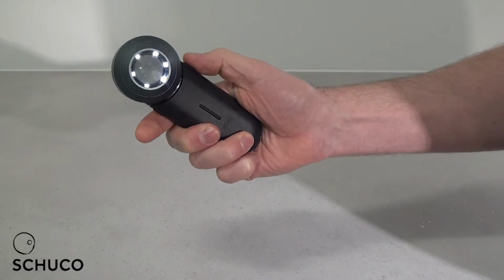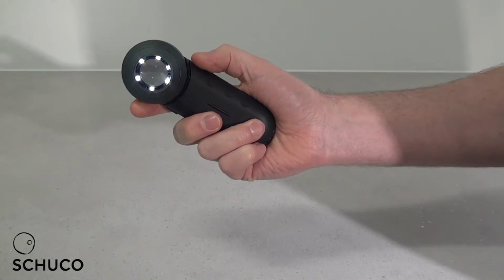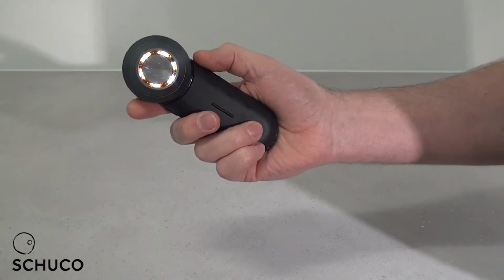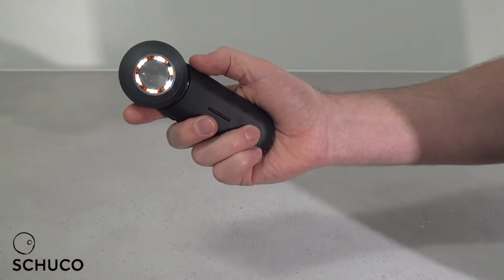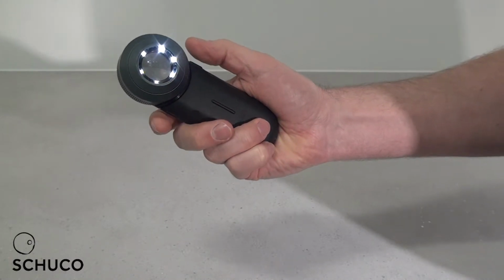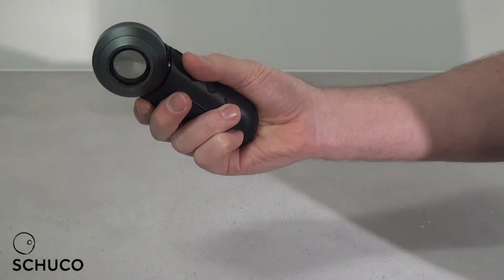The button on the left-hand side of the device here is a pigment boost button. If you press it once, you'll see some orange LEDs appear. This is used just to enhance pigment. It is not needed for the teledermatology project, but you can use it or experiment with it if you wish. To turn off the device, you just simply hold down the right-hand button again for more than a second, and the device switches off.